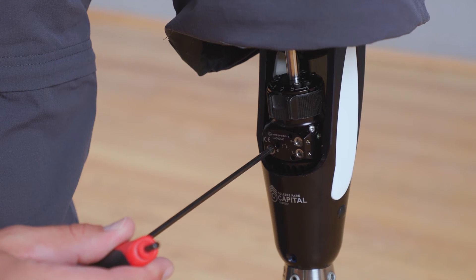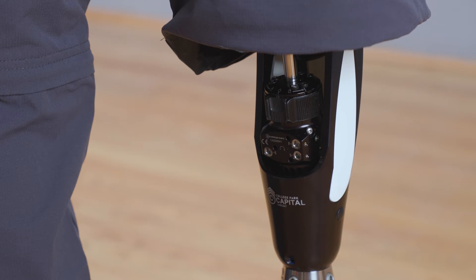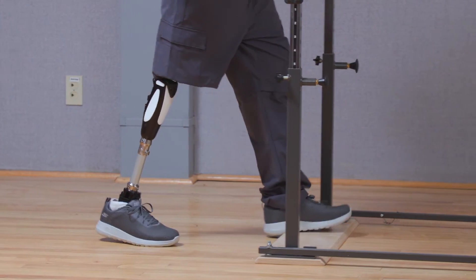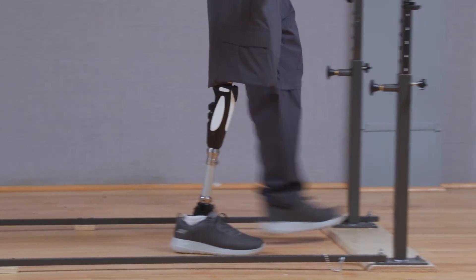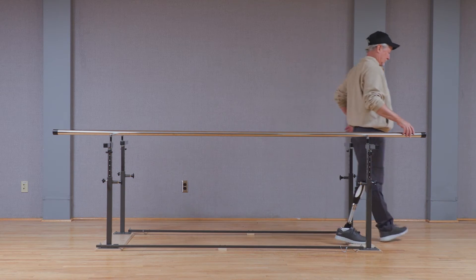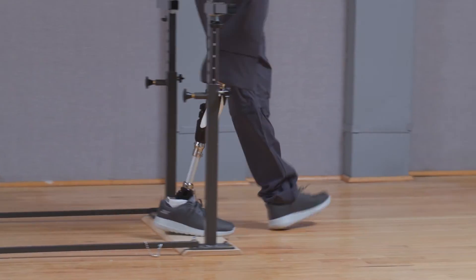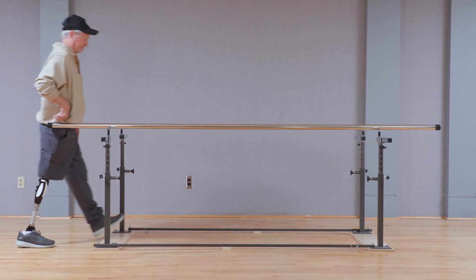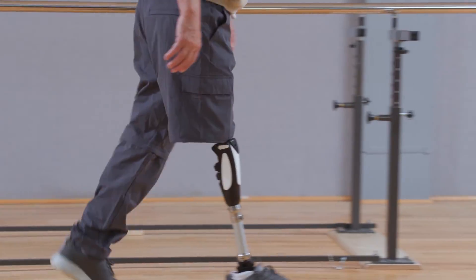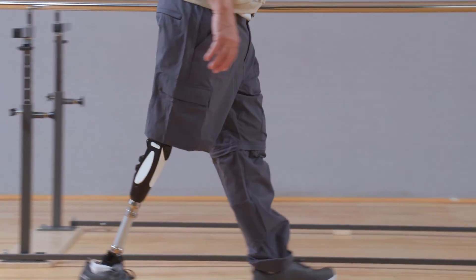Use caution when moving away from the minimum resistance for swing extension damping, as this adjustment can limit knee range of motion. If swing extension resistance E is set too low, the user may reach full extension too early or too quickly, causing a jarring of the prosthesis due to terminal impact. If set too high, the knee may not reach full extension by terminal swing phase, leaving the knee in a flexed position when loaded, which could lead to excessive flexion and instability in early stance. When both F and E settings are optimized, the knee should flex appropriately in early swing and extend fully in late swing so that the prosthesis is positioned for loading at initial contact.